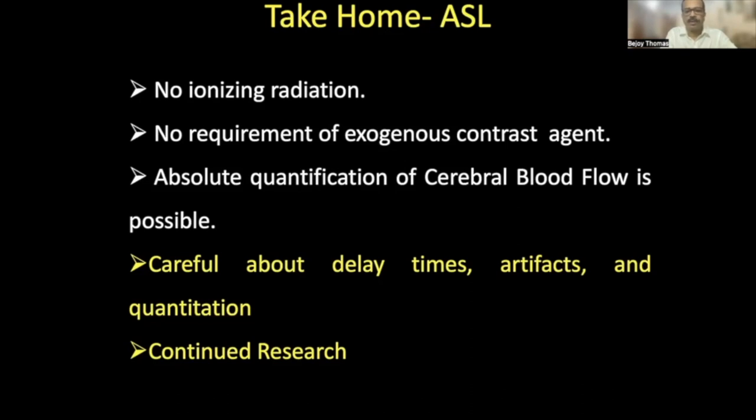Be careful about delay times, artifacts, and quantification. The most important thing is that you should understand the possible artifacts and their remedial measures, and continued research is happening in this field.